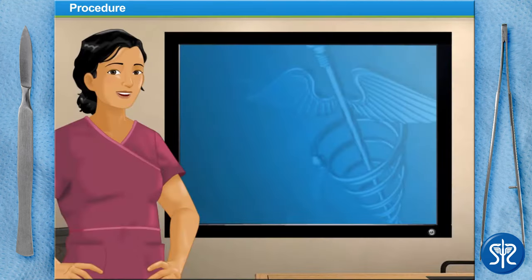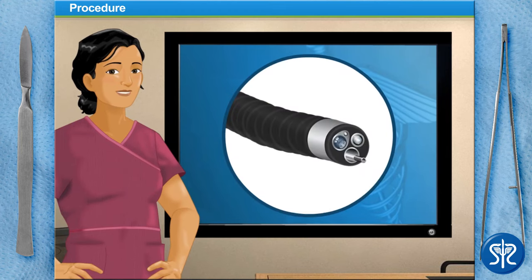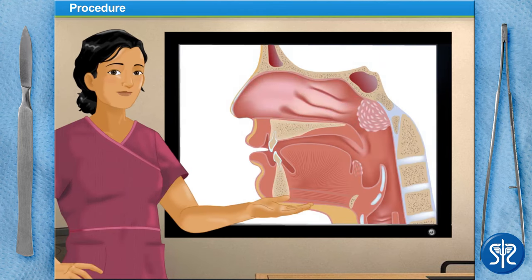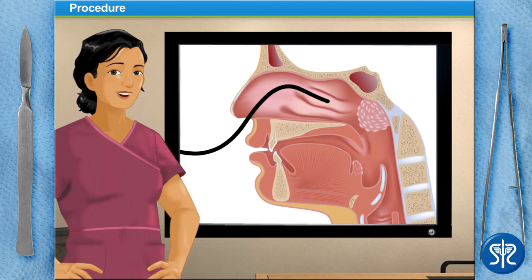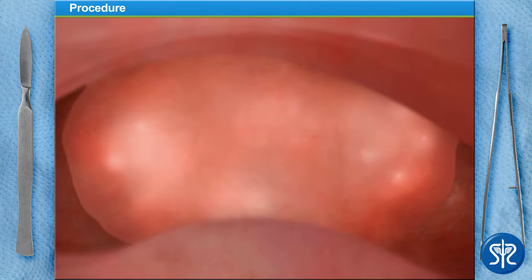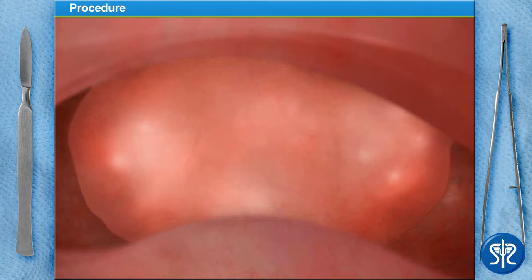We'll begin by putting an endoscope through our patient's nose so that we can view our work on a monitor. When we reach the back of the nose at the entrance to the throat, we'll be able to see the adenoids. Now we can see the adenoids.